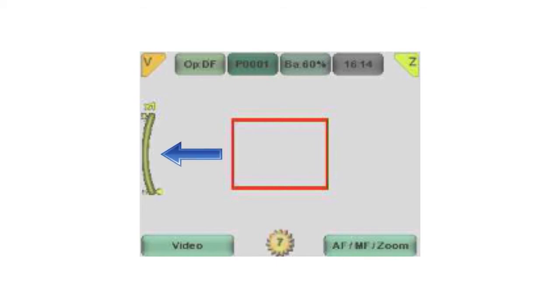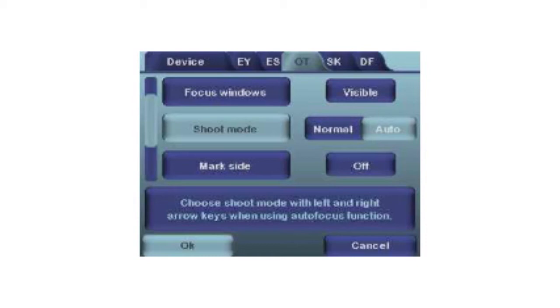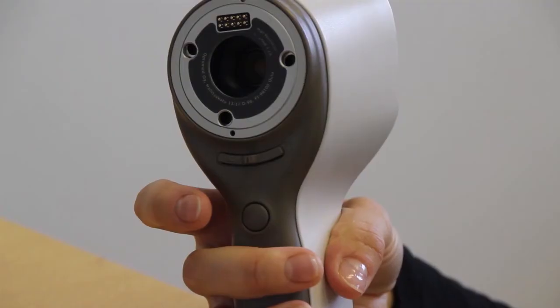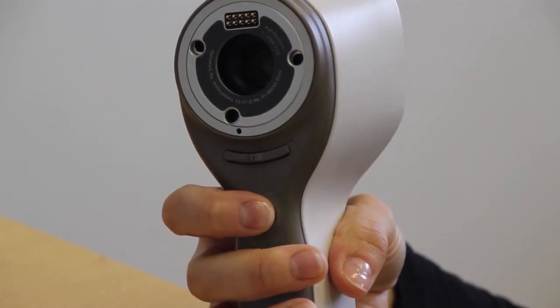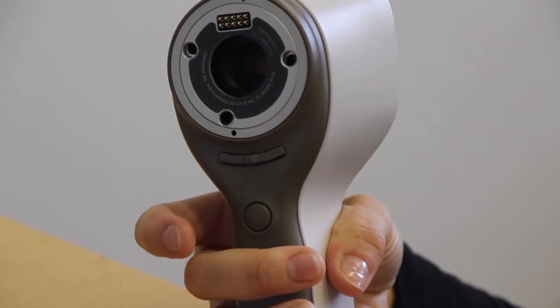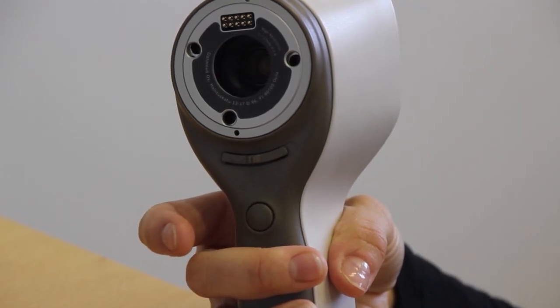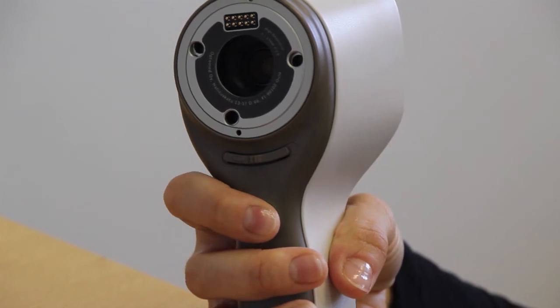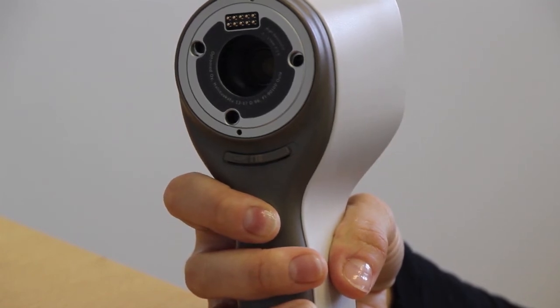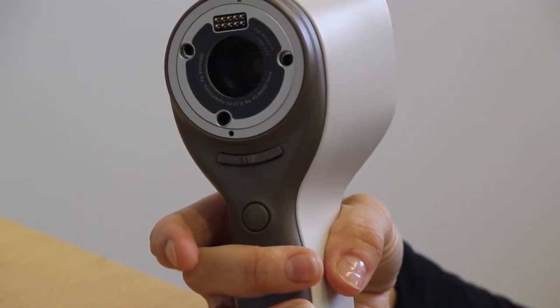We will now look at the other menu options. Shoot mode: with autofocus, there are 2 shoot modes you can select from the OT menu, normal and auto. With the normal shoot mode, the shutter button operates like a standard digital camera with a step trigger. Pressing the button halfway down first focuses the image, and the image is taken when the button is pressed all the way down.